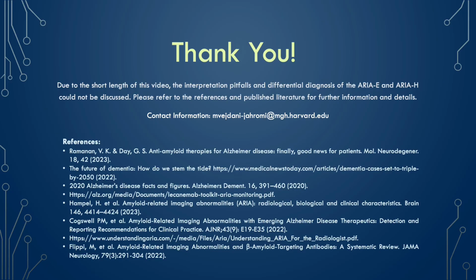We try to give a summarized overview of how to report these studies. Obviously, all details, including interpretation pitfalls and differential diagnosis, could not be covered in this brief presentation. Please refer to publications, references, and additional papers on this topic for further recommendations and specifications.